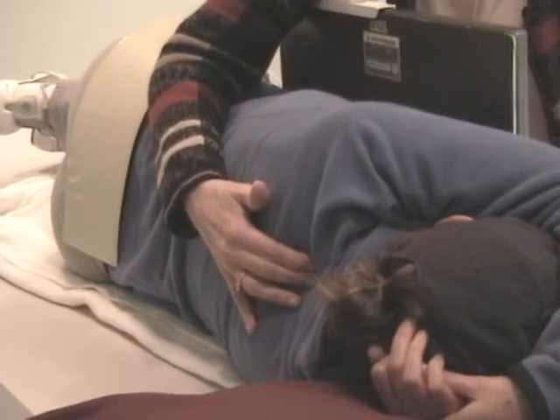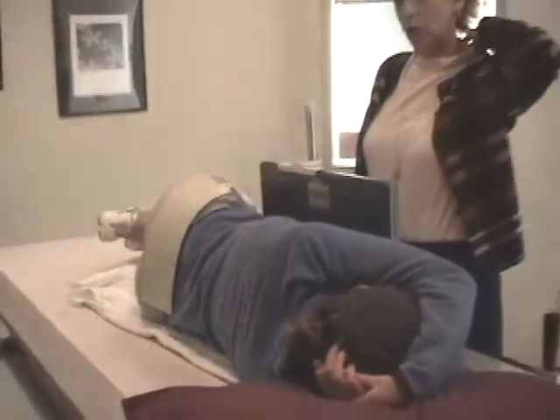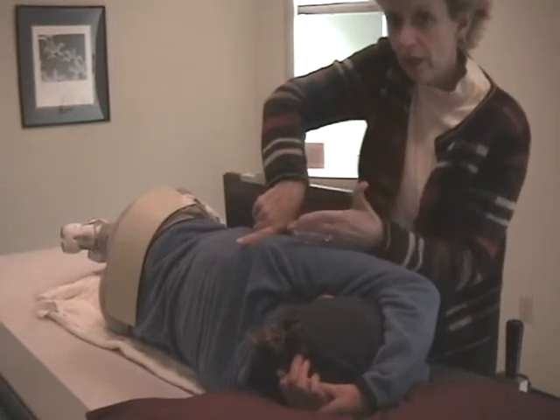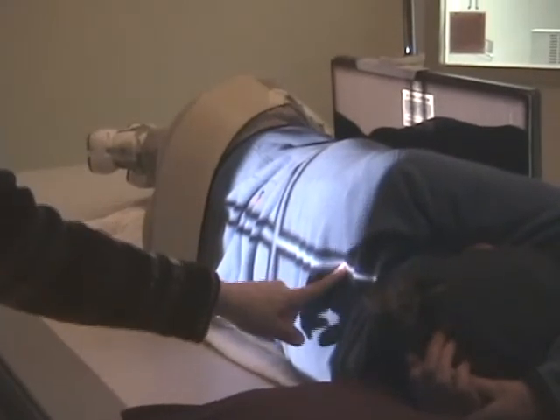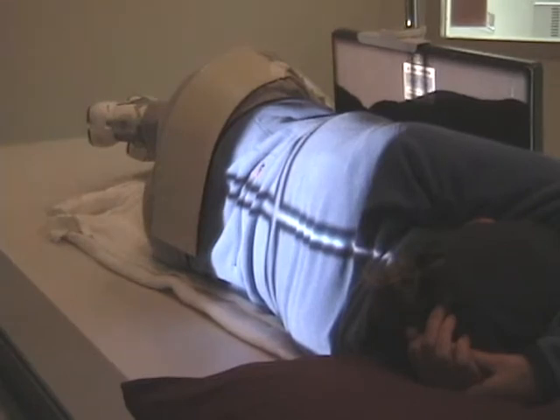When the patient's arms are in a natural position, C7 is at the level of the shoulders, the height of the shoulders. So we're just going to find cervical prominence. It's right there, and we make sure that the film's edge is 2 inches above. And again, you have your crosshair of the cassette at the 7.5 inch mark, because you want this crosshair to the center of the grid. Film's edge is 2 inches above the cervical prominence, and the central ray is exiting to the center of the cassette right here.